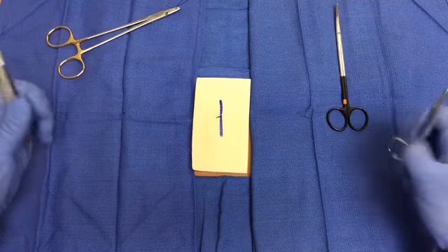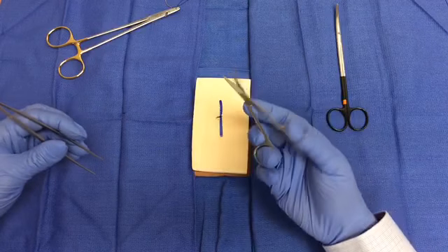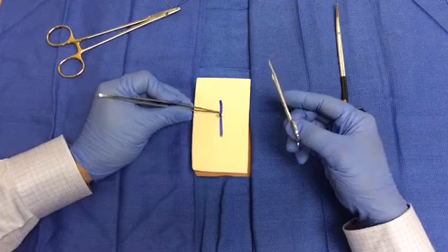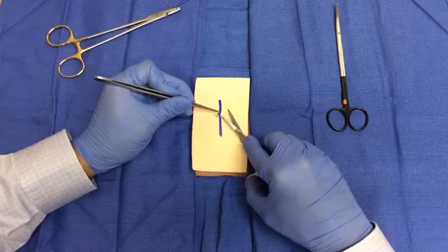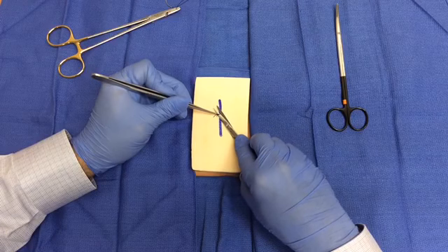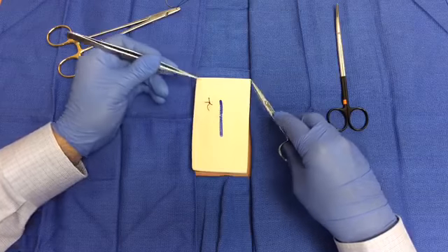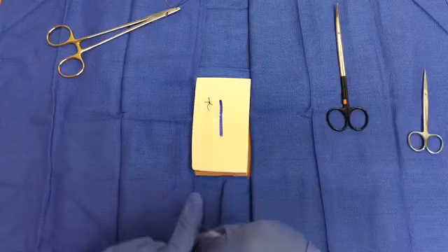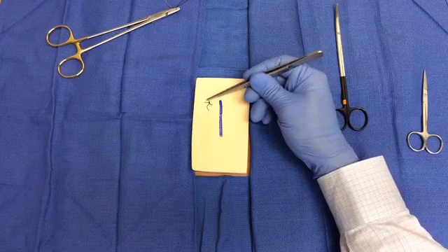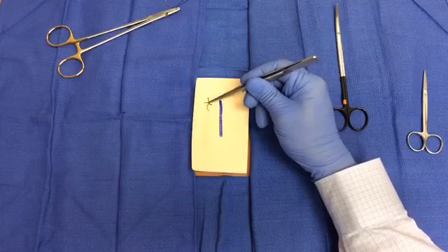When it is time to remove the stitch, you may do so by lifting up the tails of the knot with forceps, which are provided in a suture removal kit along with suture scissors. Slide the blades of the suture scissors underneath the loop of the knot and cut. Once removed, the knot may be inspected to observe its two tails, the knot, and the loop which was cut. Careful inspection ensures that no suture material is left in the patient.